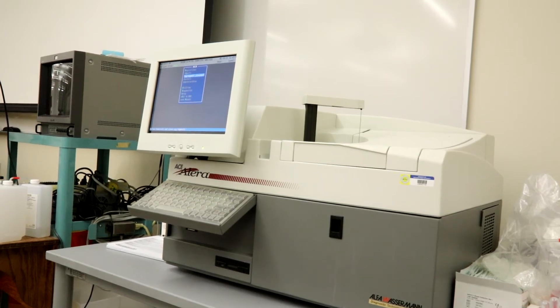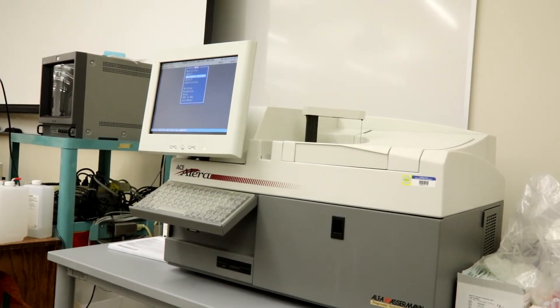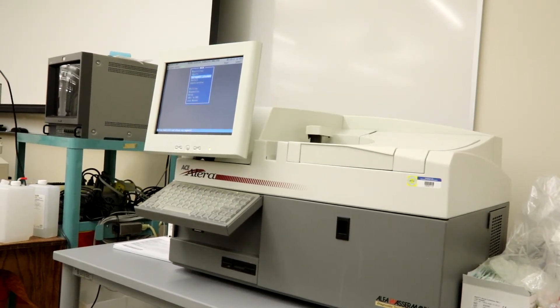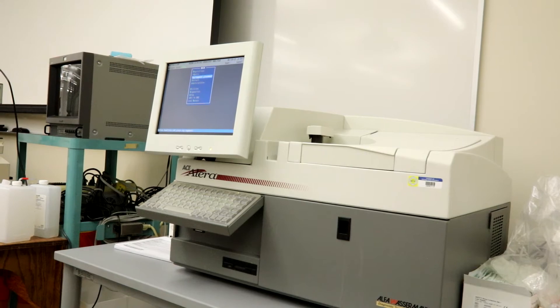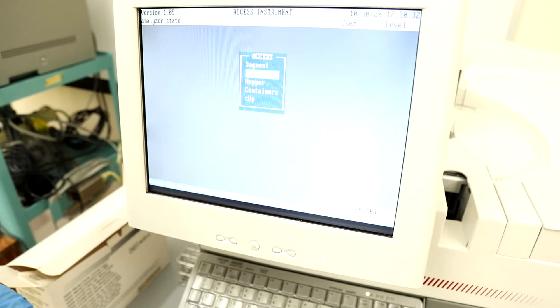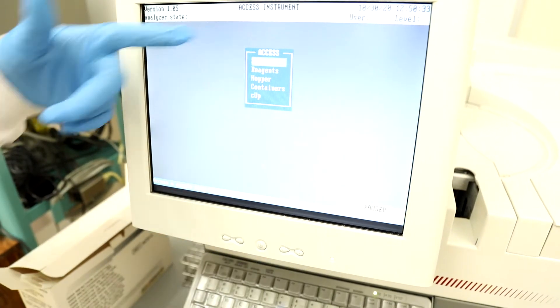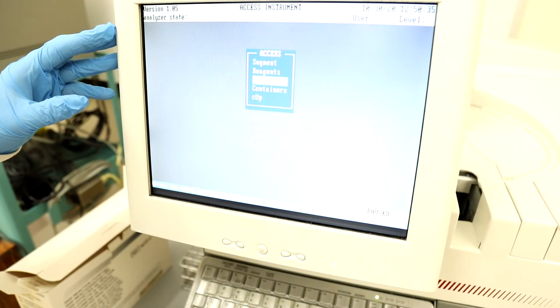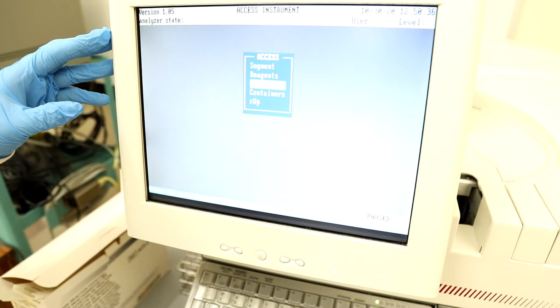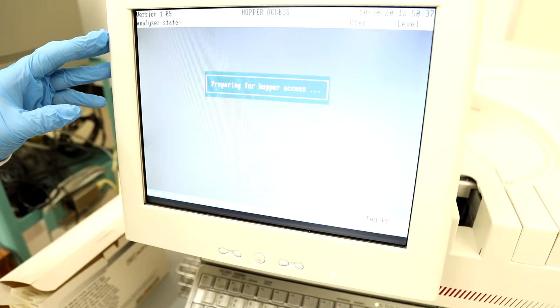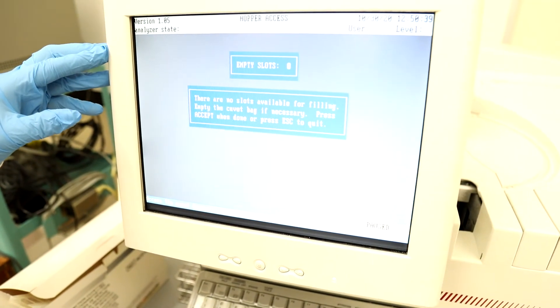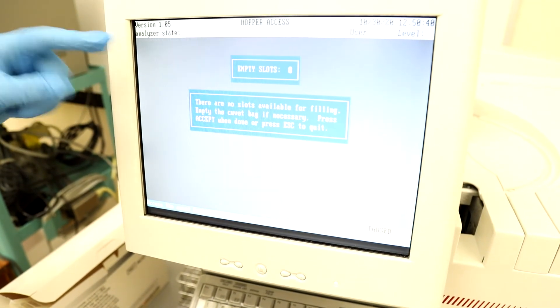Next we will check the hopper, which contains the cuvettes for testing. While still on the Access menu, select Hopper by either scrolling down until it is highlighted and hitting Enter or by hitting H on the keyboard.